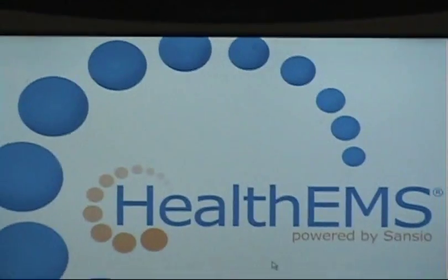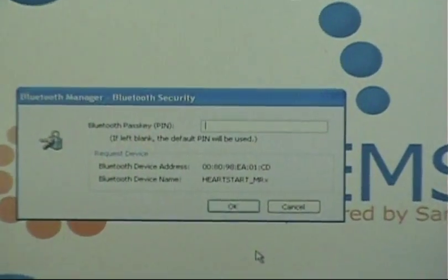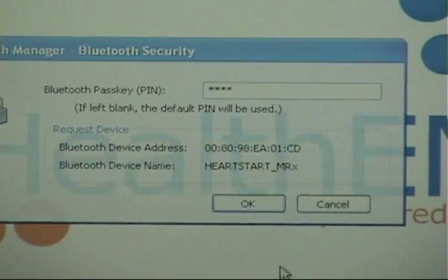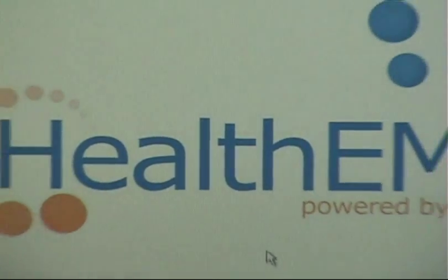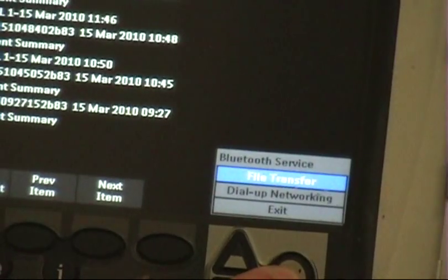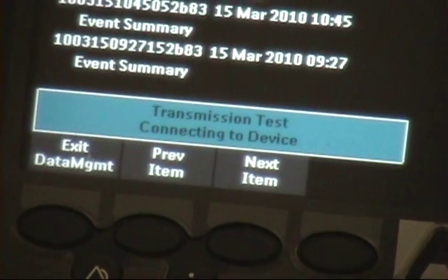Come back over to the Toughbook momentarily. While it's searching and attempting to pair, that code is going to ask you for the code over here. Hit four zeros — not 'O' as in ocean, but four zeros — then hit enter. Come back over to your Philips monitor; it will ask you for file transfer. Select that — that's the default setting. It's doing a transmission test, connecting to the device.